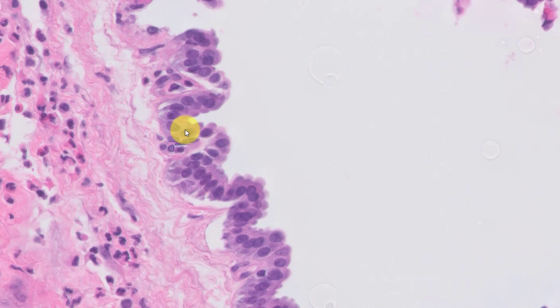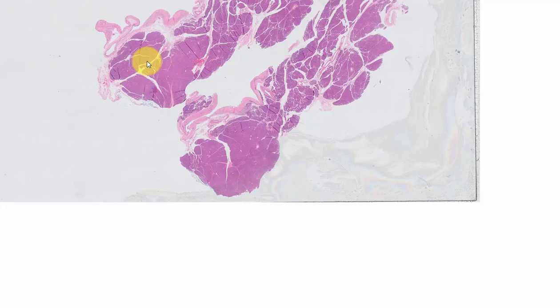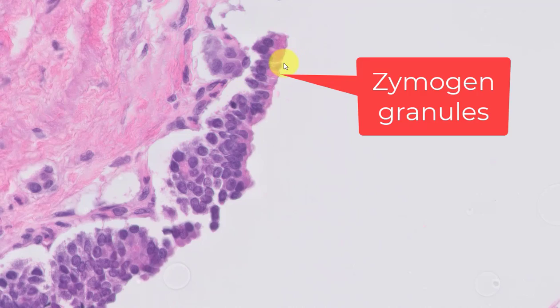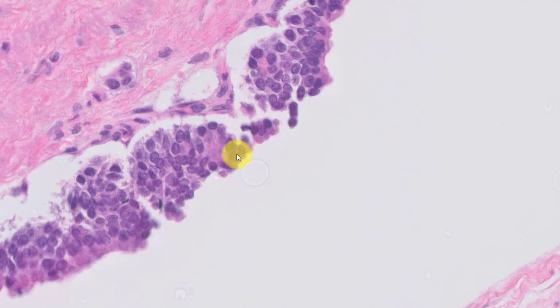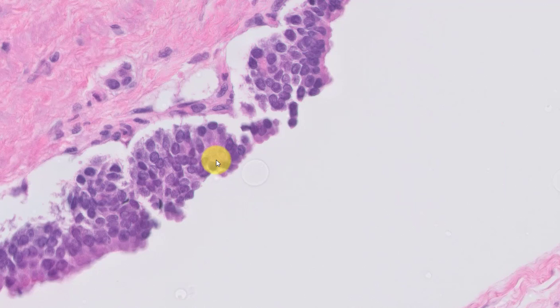Those little dips down here are an attempt to create acinar differentiation, not very overt, but there is overt differentiation back here. And this is as overt as overt can be. Notice these brick red granules. These are zymogen granules. In addition, there is overt acinar cell differentiation within that lining epithelium. So no malignancy, acinar cell cystadenoma, or acinar cystic transformation.